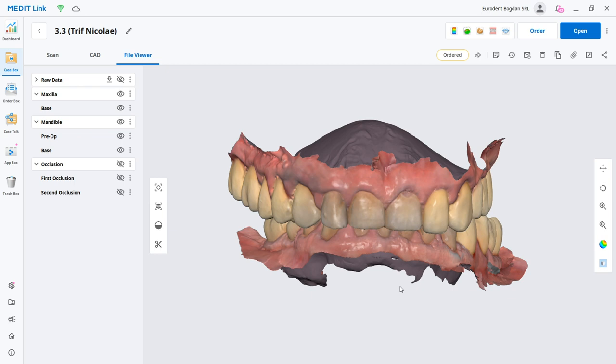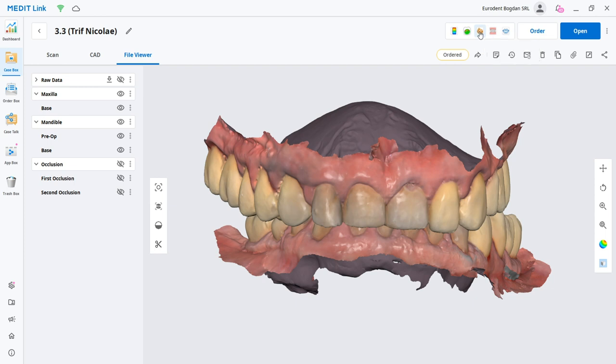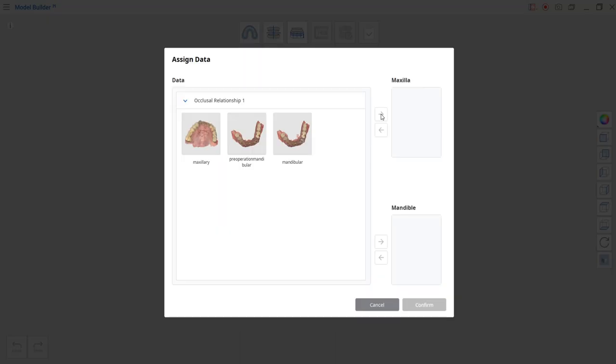So after finishing the prep and letting Medit Link process the case, we're just going to hit the model builder button up here on the right and the app is going to start right away. It's going to ask us to first determine what occlusal relationship to use for this case and what parts of the scans we need to process.